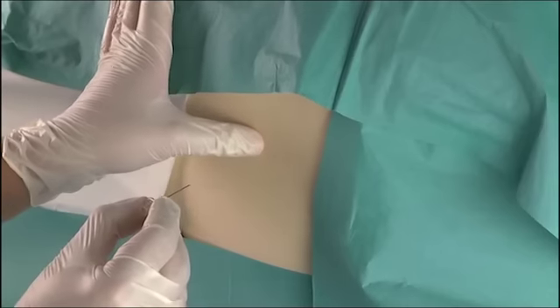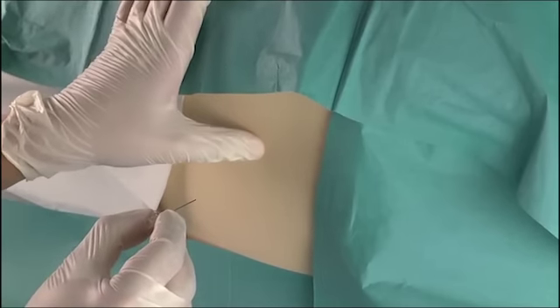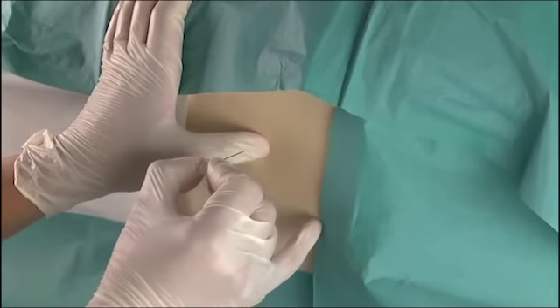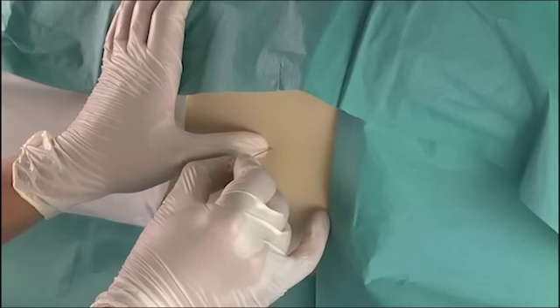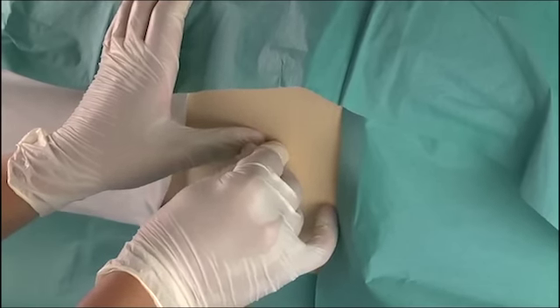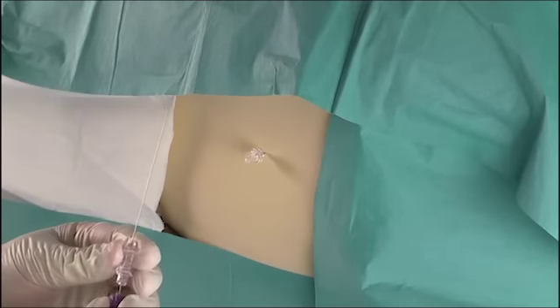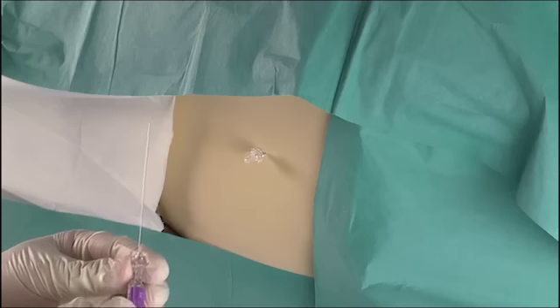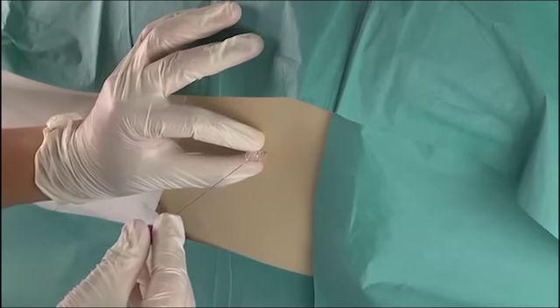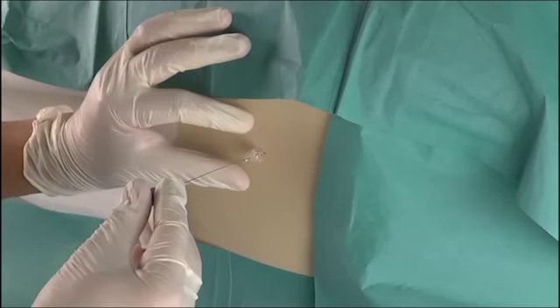Now the lumbar puncture needle, which is best performed with a two-stage device which contains first an insertion component. Again, find the position and insert the insertion component horizontally. This allows you to pass through the subcutaneous and muscular tissues and through the ligamentum flavum. This now allows you to pass a thinner, much more flexible needle with stylet, which results in fewer post-lumbar puncture headaches, as there is less dural tear.